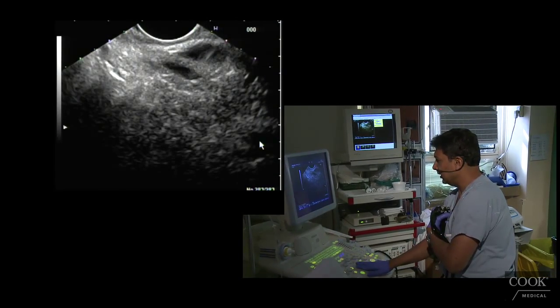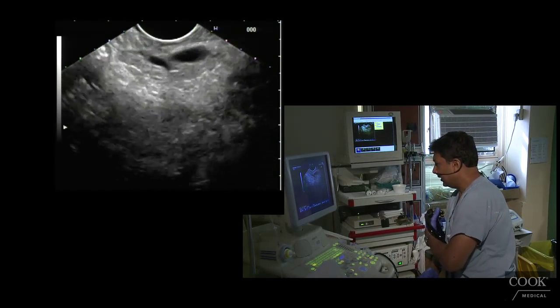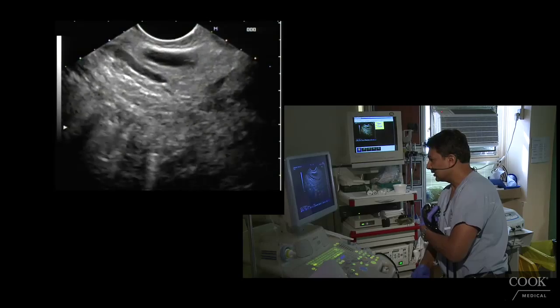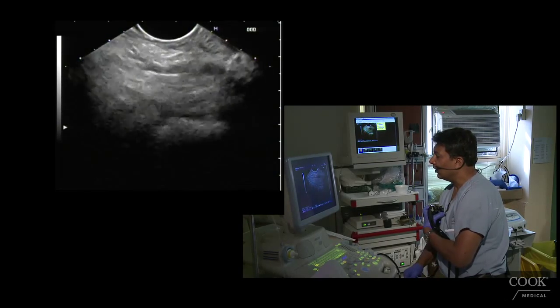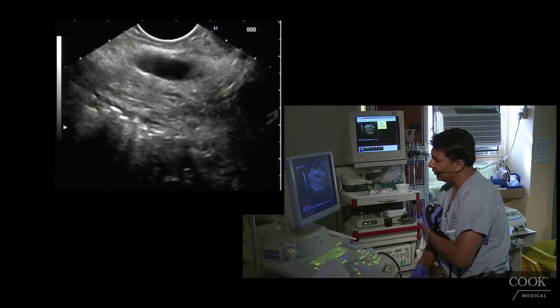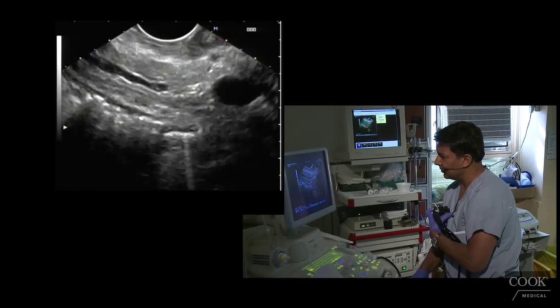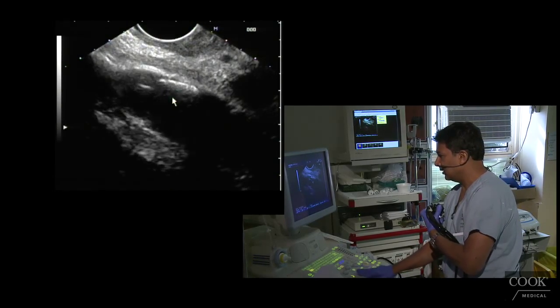This is where you'll see the IPMNs and the uncinate. He doesn't have one, but they're just coming back across the genu. So this is how you get a long view of the PD and a long view of the bile duct with a linear scope. You can get an excellent long view of the bile duct with the linear scope by coming back this way. Now I'm coming back across the genu, okay?